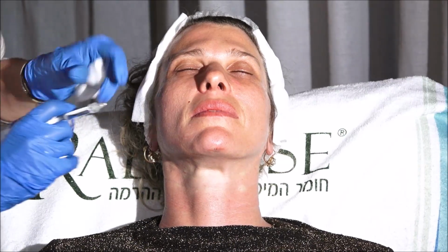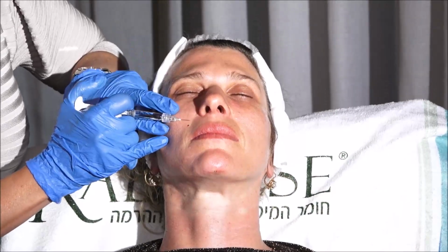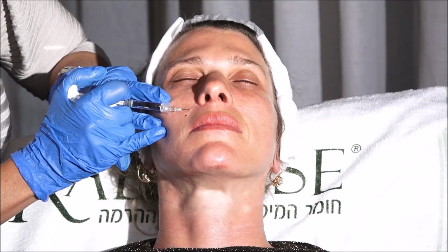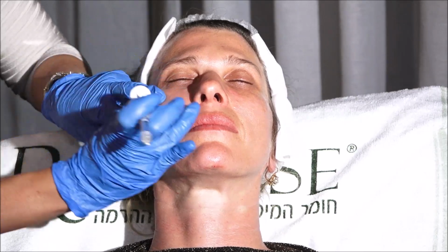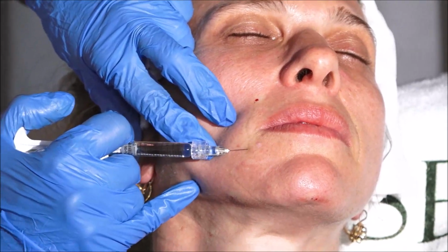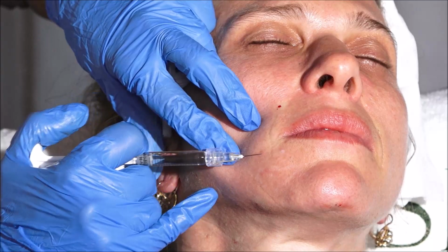Let's finish the nasolabial fold. So the secret here when you do blanching is to go across the wrinkle. The wrinkle is here. I go across, very superficial, and if you could give me a zoom just here, because it's easier to see the papule. Yes, perfect. So here, really superficial, and you give it a bleb.